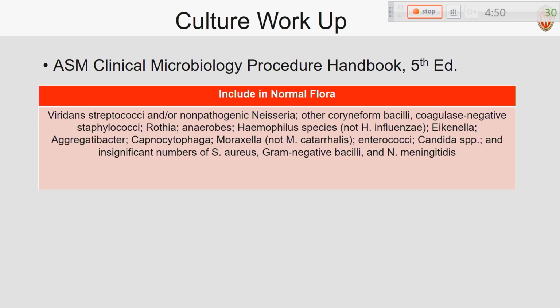As Tyler mentioned with the gram stain, there are some things that we should include in normal flora, and these are the things that are going to be the upper respiratory tract organisms. I am certainly not going to read through every single one of those, but again, it makes some sense in the reporting of the cultures to list the things that are potential pathogens and not give providers information that may be misleading or lead to additional treatment that's not needed.